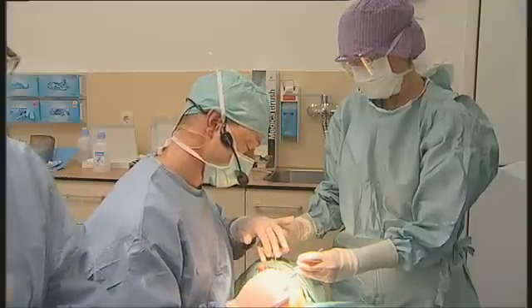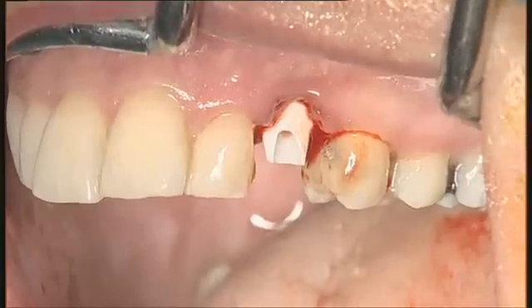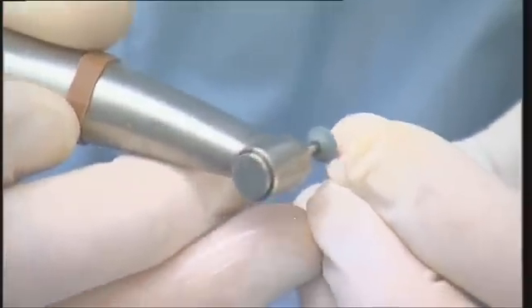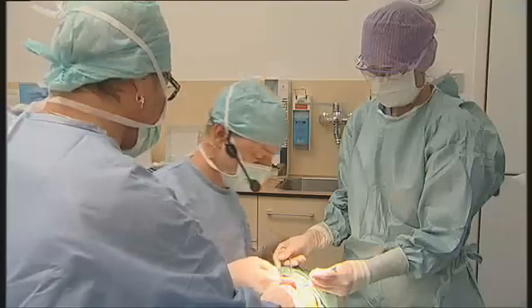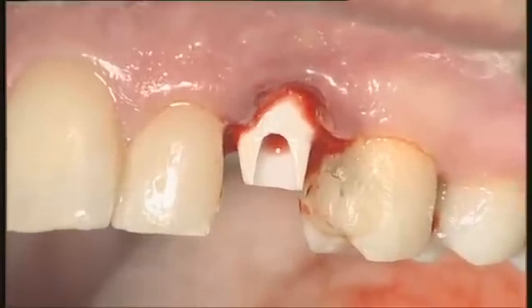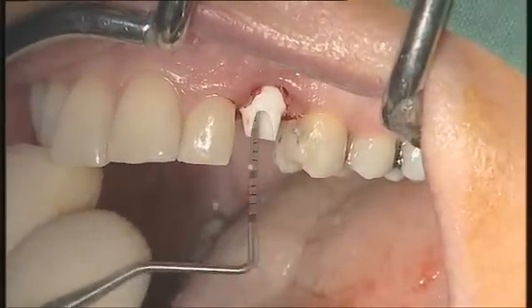Now we will use this diamond kit for a Procera zirconia abutment to slightly adjust the shape of the crown. We are now able to settle the provisional crown quite correctly.